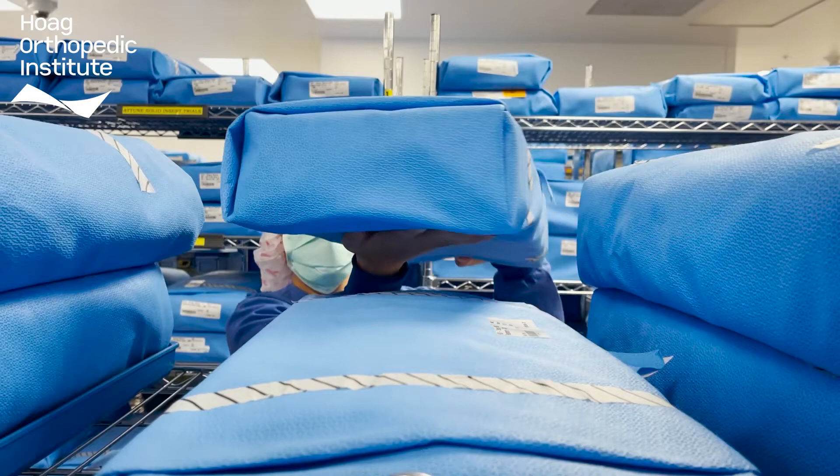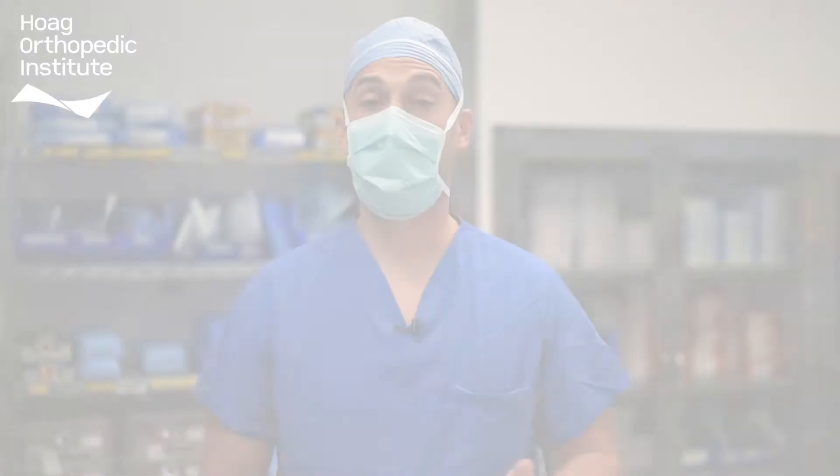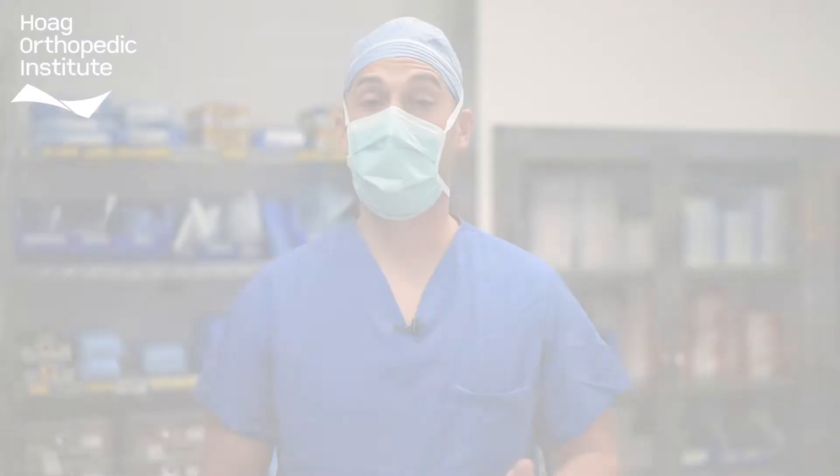Finally, once the instruments are ready, they're assembled onto a case cart along with the soft goods needed to perform the next surgery. Thank you for taking the tour of our sterile processing department. It is our pleasure to serve you, our community, and our patients. Please recognize our sterile processing staff for their excellent service, patient care, and high quality standards.